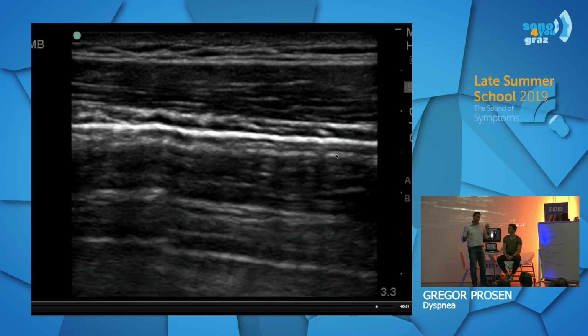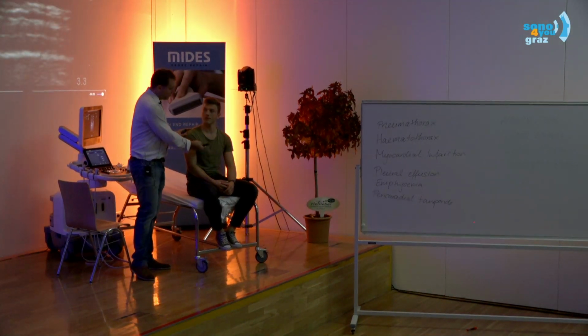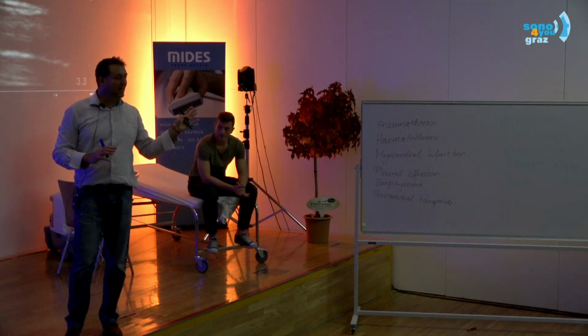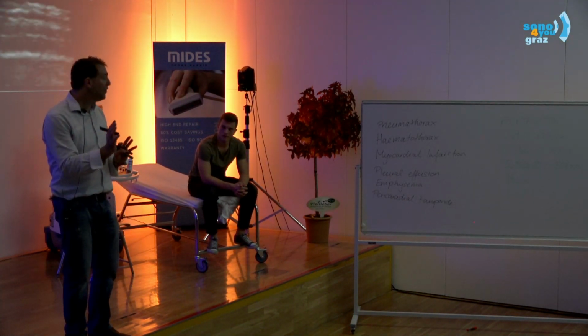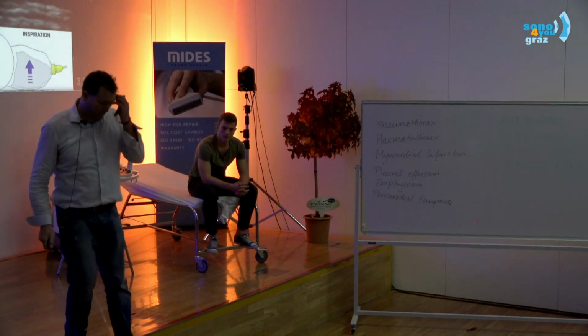And then we, of course, did X-ray, and there is clearly a pneumothorax. What went wrong? Well, his pneumothorax went up here, because the lung apices are here. Okay? So be very cognizant. Ultrasound, unlike CT or Röntgen, you create your own images, and if you position the probe wrong, your interpretation will be wrong. Okay? One thing to think about.